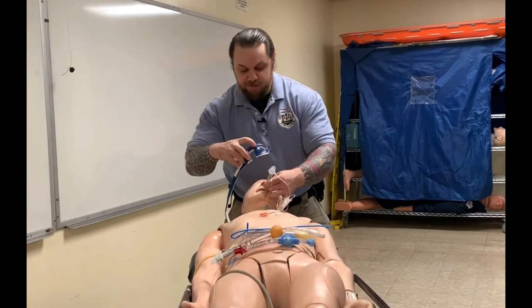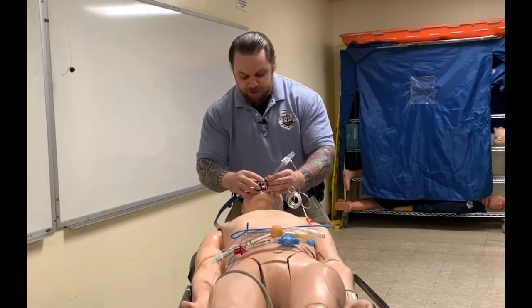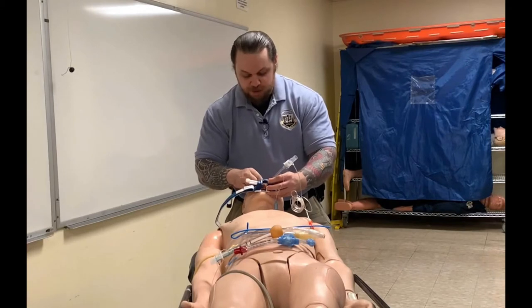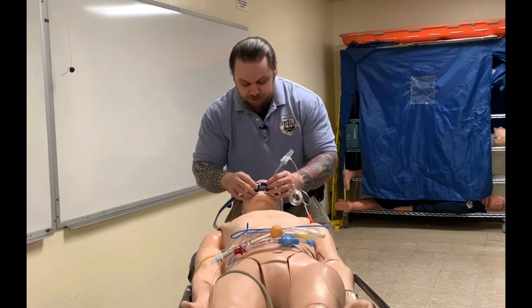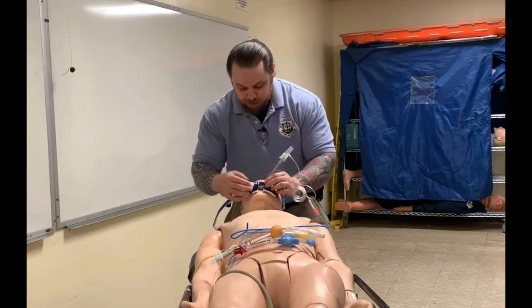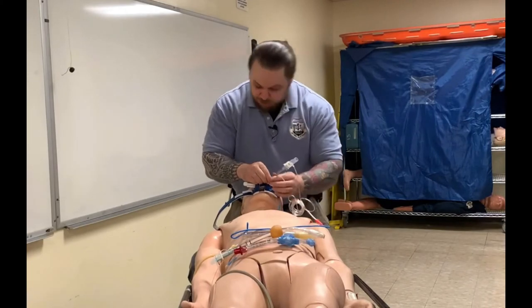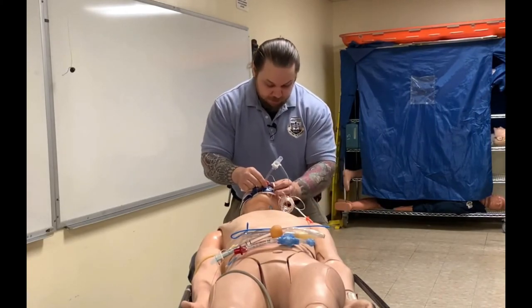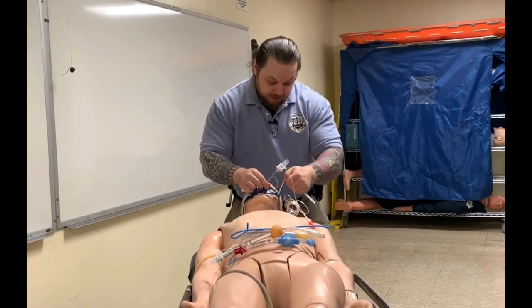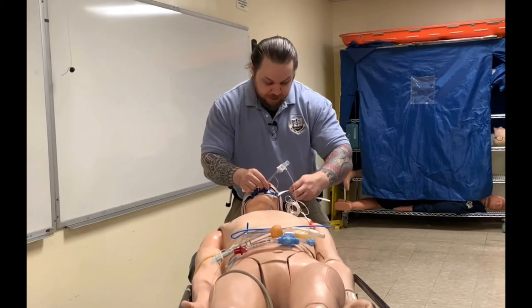First, I'll slide the tube into the V-wedge. Once the V-wedge is in place, I'll carefully place the bite block into the patient's mouth, making sure the lips or any soft tissues are not obstructed — I don't want any damage to soft tissues. The bite block is now firmly seated. Then I'll find my slider clamp and slide it through.